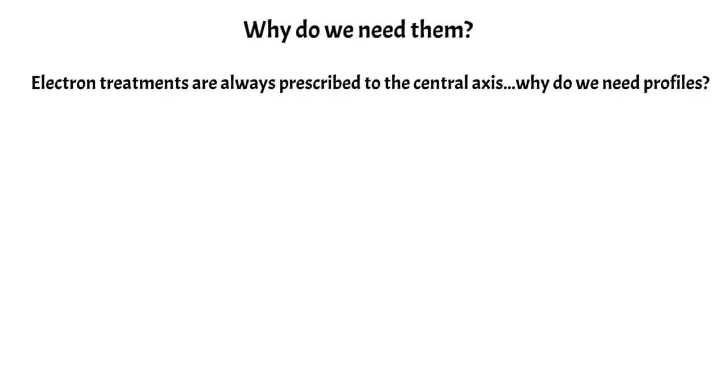In this video we're going to be discussing the electron formalism, and specifically we're going to be talking about electron profiles. So why do we need electron profiles? We know that electron treatments typically are prescribed to the central axis, so there's really no use for them for the purpose of a hand calculation.